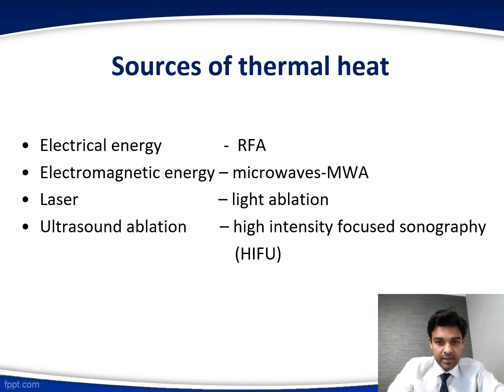Sources of this thermal heat. So where does all this heat come from? For various ablations, it's different forms of heat. For radiofrequency ablation, it is electrical energy. For microwave ablation, it's electromagnetic energy. For light ablation, it's laser. And for ultrasound ablation, as I said, HIFU, high intensity focused ultrasound, basically sound waves.